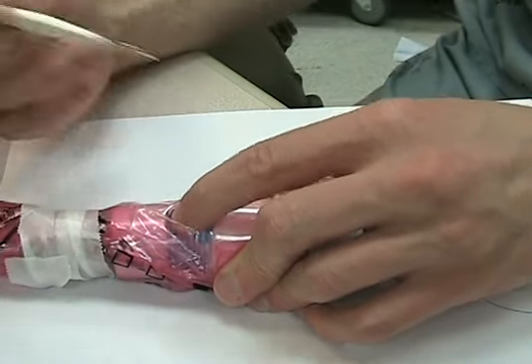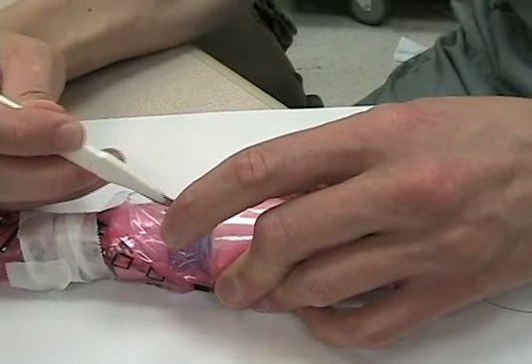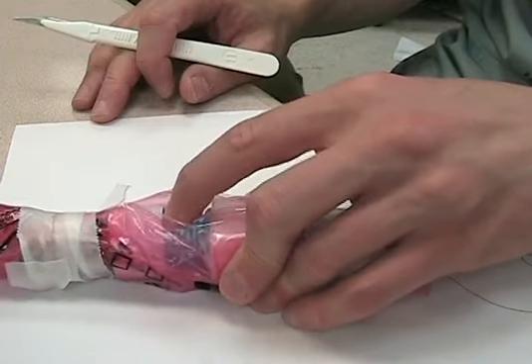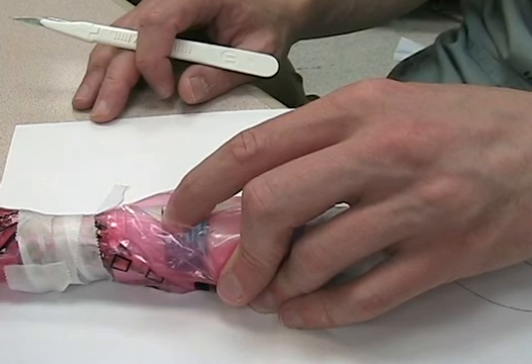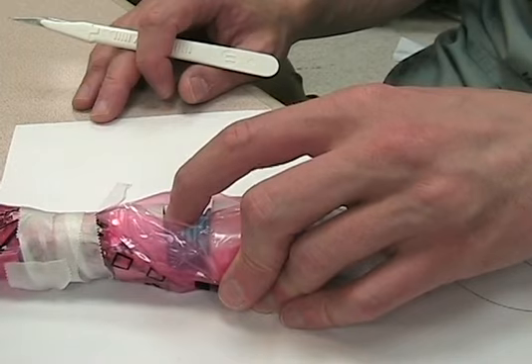Once you've identified those landmarks, grab your number 11 scalpel. You cut from the thyroid all the way down to below the cricoid — that's your skin incision. Get your finger through the skin and feel the cricothyroid membrane again with your index finger. From this point on, it's all feel. You don't have to see anything — you can do this with your eyes shut. Sometimes there's going to be so much blood in there that that's essentially what you'll be doing.